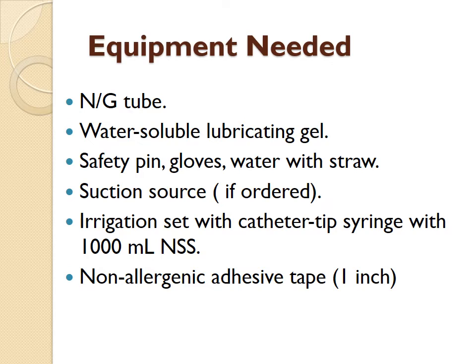If it is greater than 7, chances are you have gone through the trachea and it is now in one of the lungs. However, there are other signs that can indicate that it is in the lung cavity. Usually continual gagging and unexplained coughing lets you know that it has traveled through the trachea and is now somewhere in the respiratory tract.